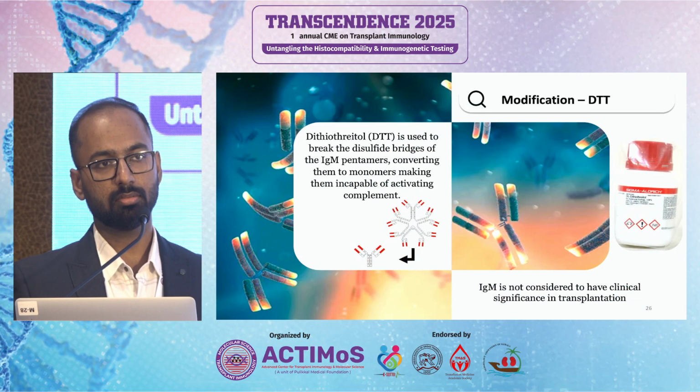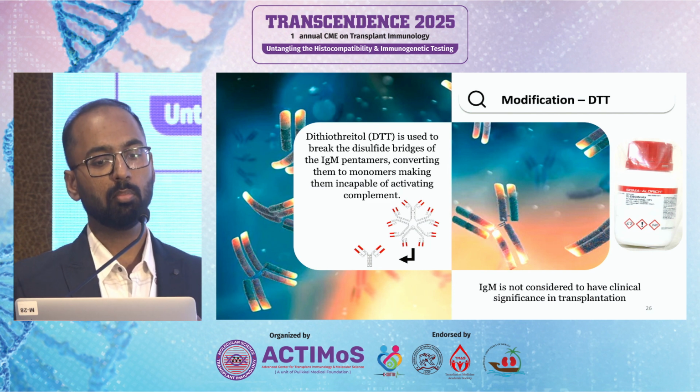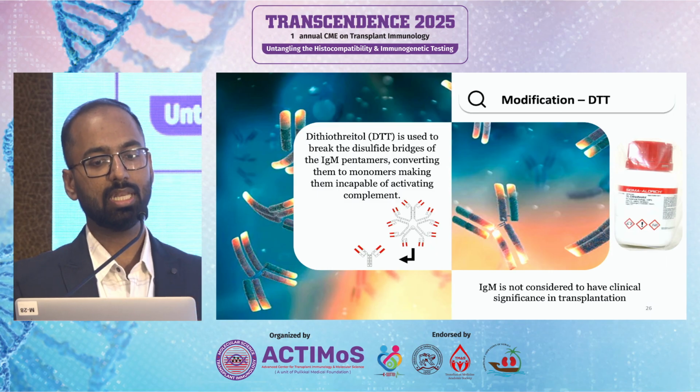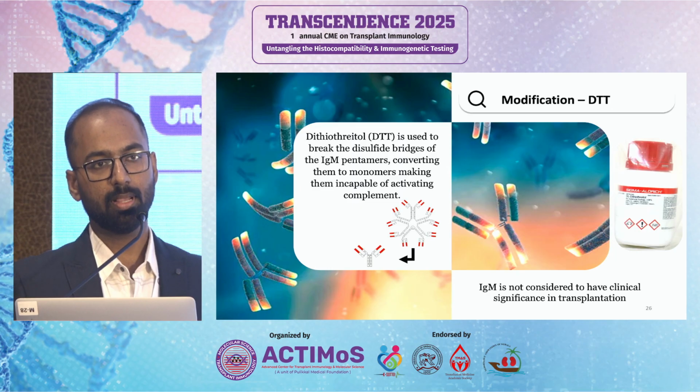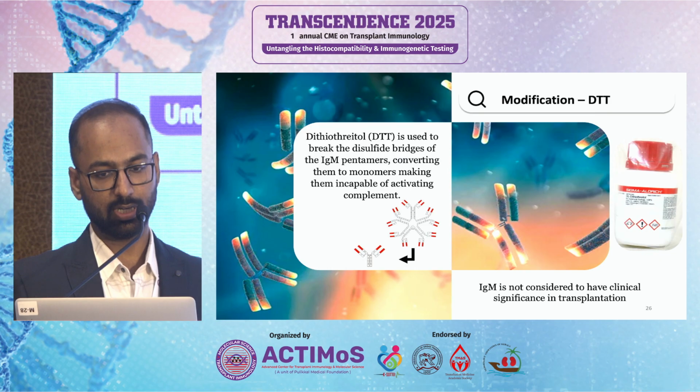And we use a reagent called DTT to differentiate whether it is an IgG or IgM antibody. How it works is that it breaks the IgM pentamer and converts it into monomers, so that complement is not activated. IgM antibody is generally considered clinically insignificant.